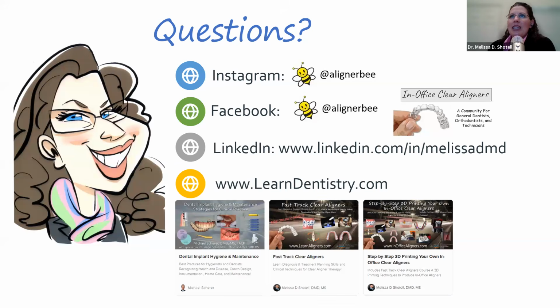So I was asked here, what vacuum forming machine do I recommend? I recommend any of the pressure forming machines. I myself have a Mini Star, but any of the pressure forming machines are what you want to look at. The old style vacuum forms where you have to pull down the sheet of plastic don't have as good of contour and adaptation to the models. So I would look at anything that is pressure forming.